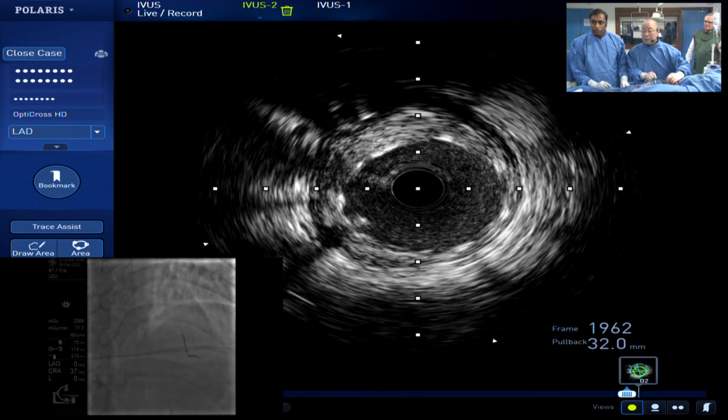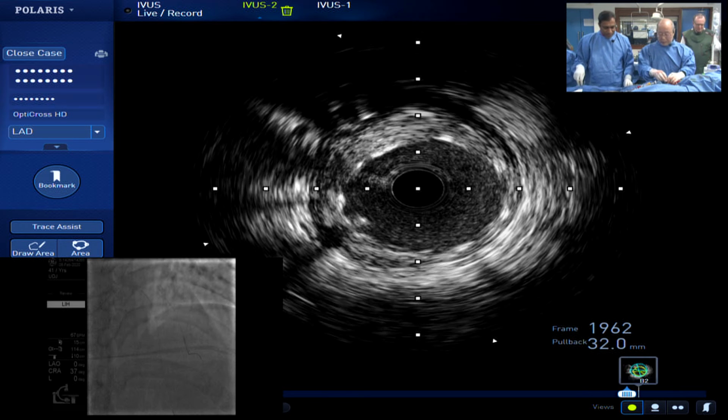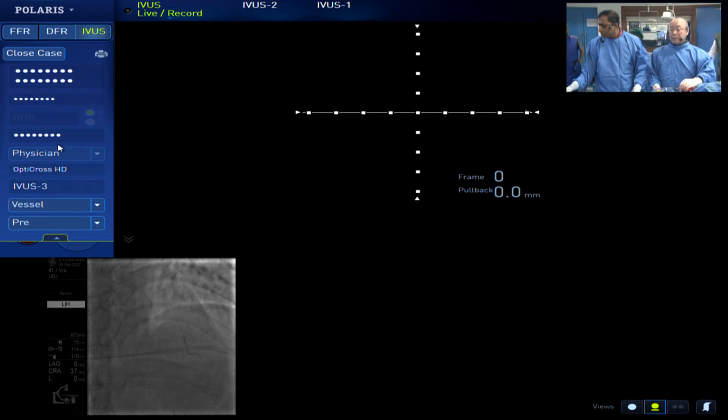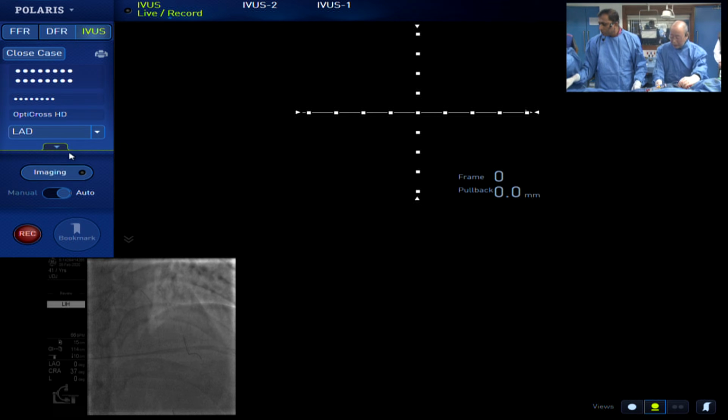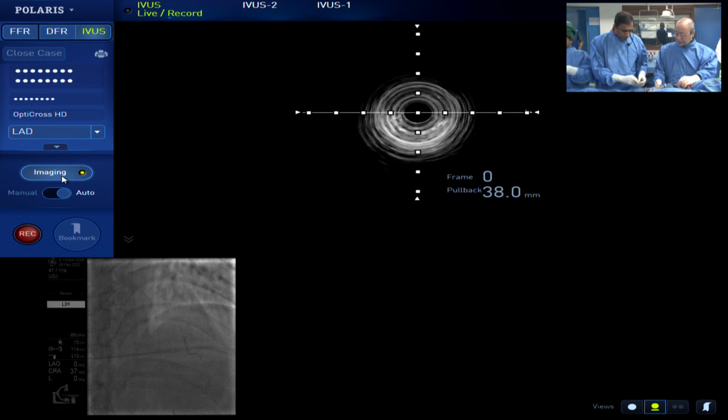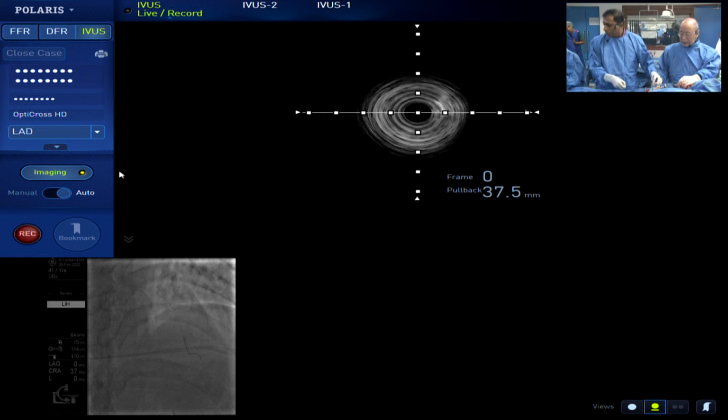Professor Akasaka, can I ask you one question in the meanwhile? I read in some studies that in the left main bifurcation, it may be okay to do the proximal crossing, while in the non-left main bifurcation, it's always better to do the distal. Is there any data on that? I think we have not compared them separately, but even in left main bifurcation or non-left main bifurcation, if there are lots of struts on the carina side, there is some risk of restenosis. That is the reason why we recommend distal cell selection. It makes a much better condition, yes.